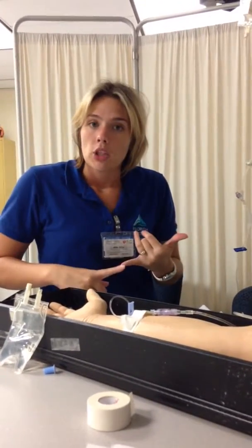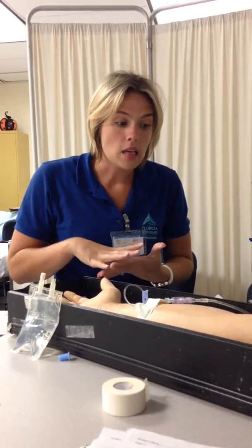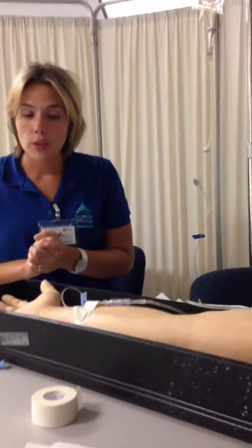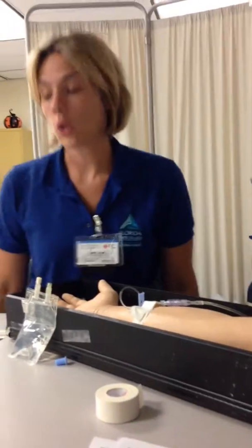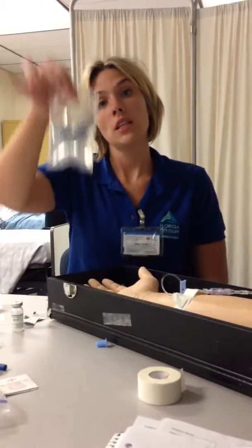Now I have checked my patient's MAR. I have the right route, the right patient, the right dose, and the medication makes sense, and the frequency and administration. Okay? And so initially what I will start with is I need to pull up my 2 mLs of my medication so that I can inject it into my bag.